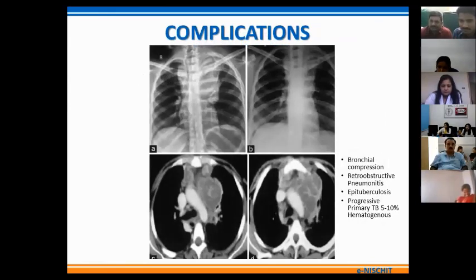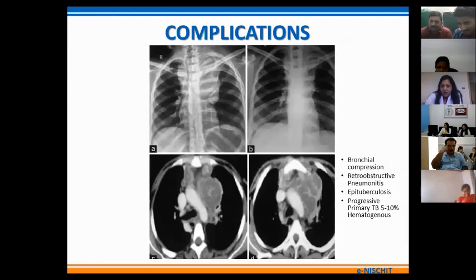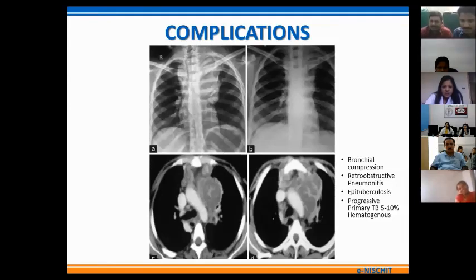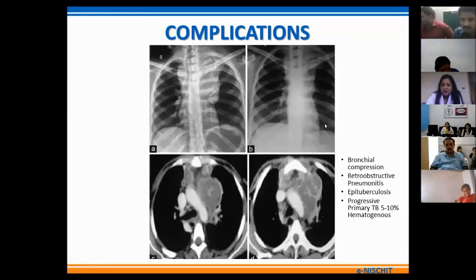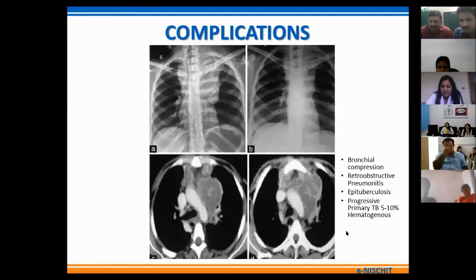The enlarged lymph nodes in the mediastinum or the hilar region can persist for a long time and continue to be seen on chest X-ray even after completion of ATT or adequate disease response. This chest X-ray of a child shows widening of the paratracheal stripes on both sides, more marked on the left. Comparing the pre-treatment and post-treatment X-rays, though there is significant resolution in the dimensions of the lymph nodes, the nodal enlargement continues to be seen. On CT, the lymph nodes appear as conglomerated lesions with low-attenuating centers due to caseous necrosis.